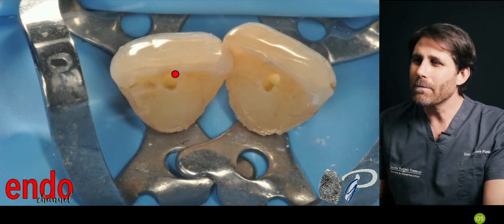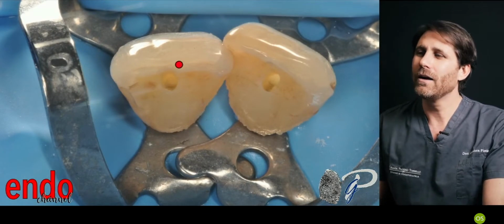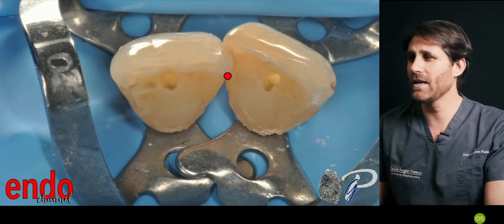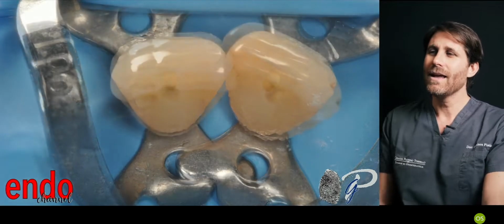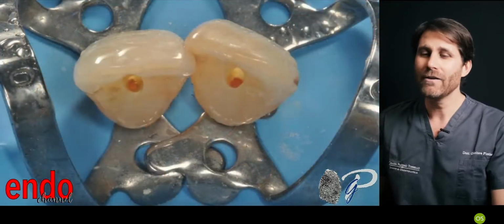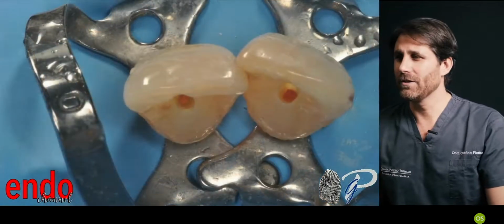Just, you can see, you can touch a little bit the marginal incisal edge if you need, without going buccally from an aesthetic point of view. And perform your treatment through these spaces. You can clean, fill, and save these teeth.